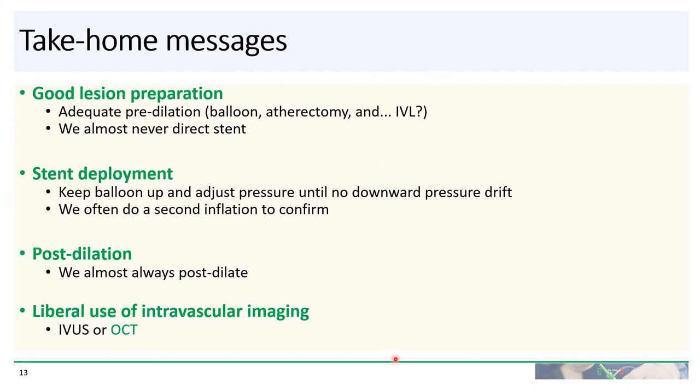For stent deployment, I use a protocol that is similar to the pressure optimization protocol. We keep the balloon up and adjust the pressure until we don't see any further downward pressure drift in the endoflator. So I don't have a set balloon inflation time. We will also often do a second balloon inflation just to confirm that there is in fact no further downward pressure drift. We almost always post-dilate the stent and use intravascular imaging liberally, especially to guide post-dilation. I also tend to favor OCT over IVUS for the superior quality of the images.